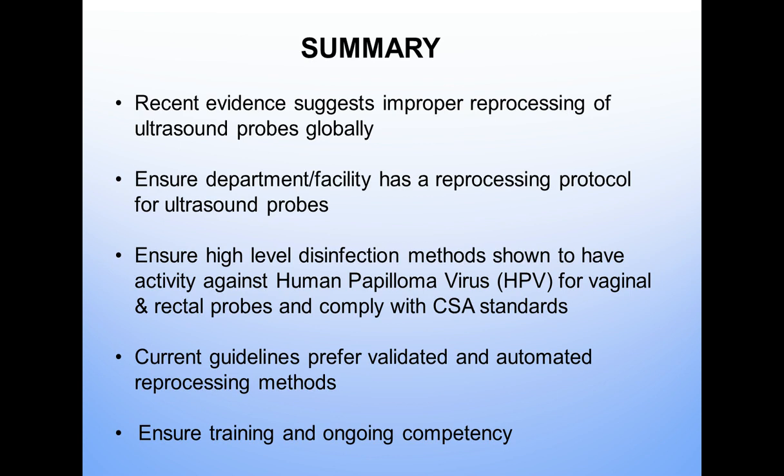And in summary, I just want to review what I've said: there is recent evidence that suggests improper reprocessing of ultrasound probes globally. What you can't see and what you don't know is very important. So it's very important that we all support the standards and ensure that you educate your managers and your supervisors and whoever in your department or in your health authority, that you need to ensure that they see the evidence that you need to follow proper protocols.